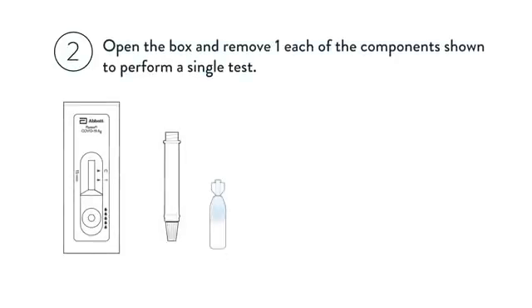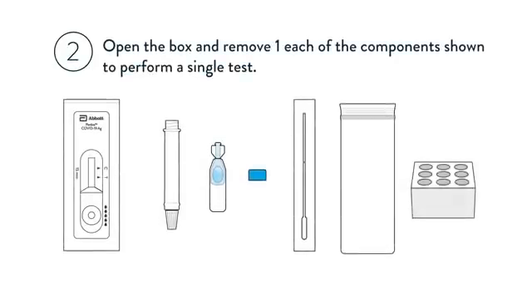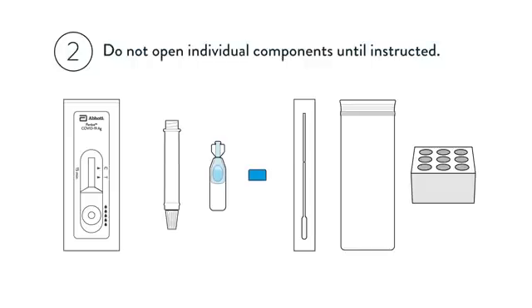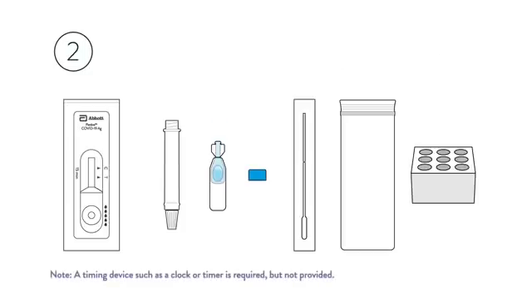Open the box and remove one each of the components shown to perform a single test. Do not open individual components until instructed. A timing device such as a clock or timer is required but not provided.